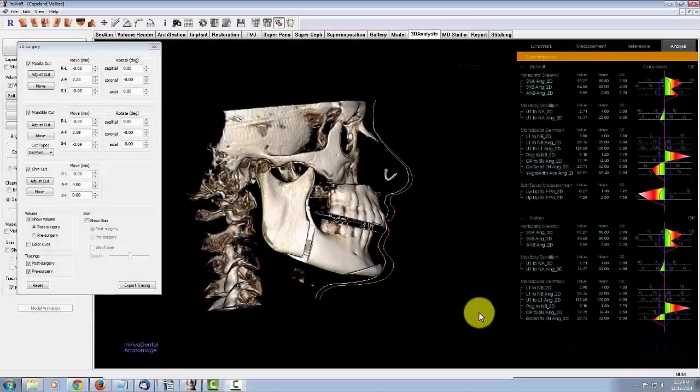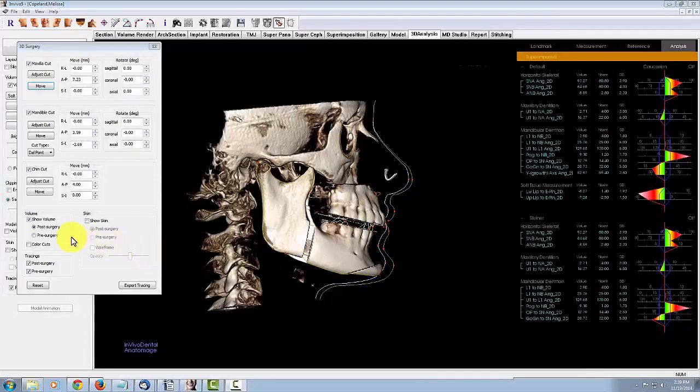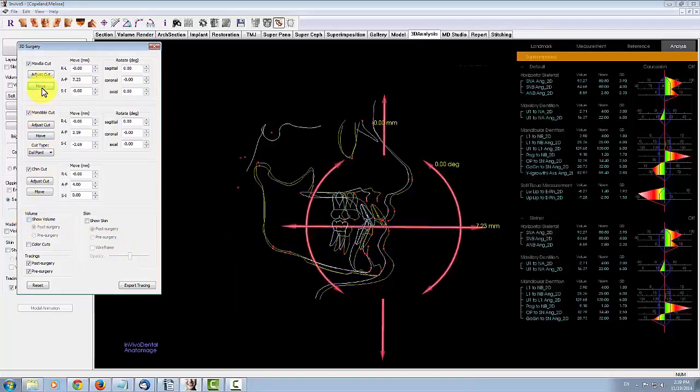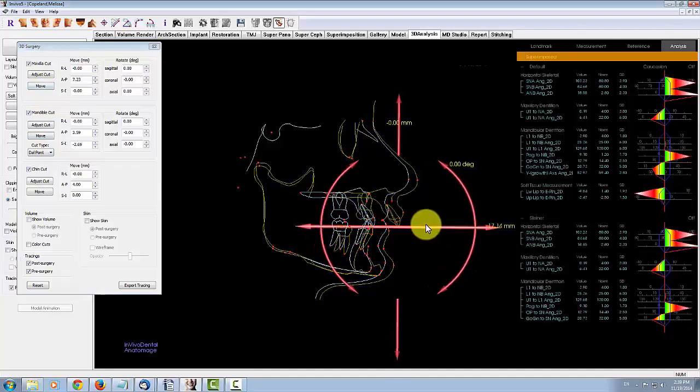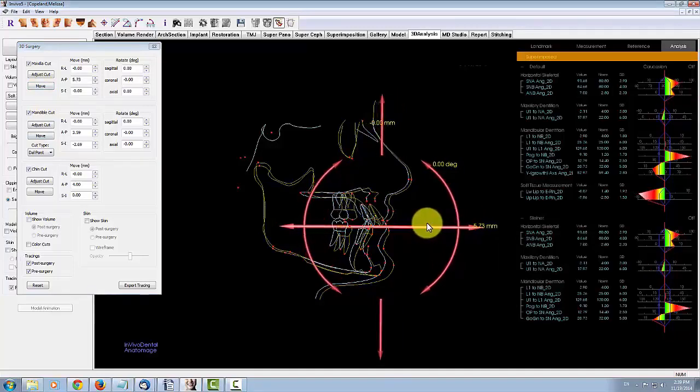The software generates a second tracing that updates as you perform cut movements to represent a post-surgery tracing. To better visualize the tracing, you can toggle off the visibility of the volume. All of your measurements and analysis data will be updated as you perform cut adjustments.